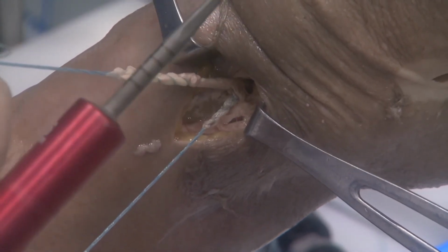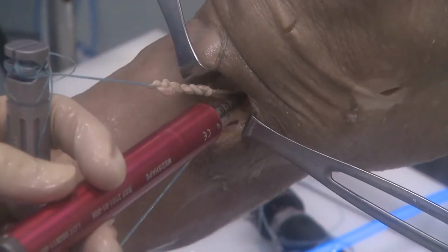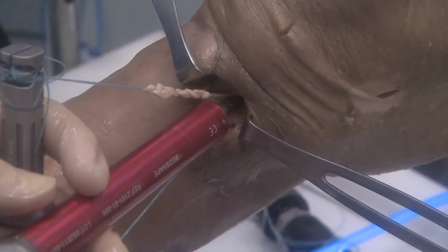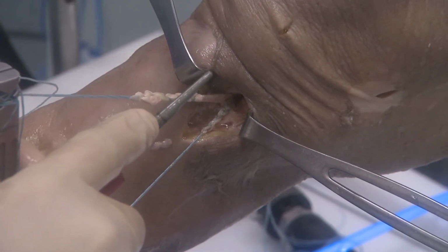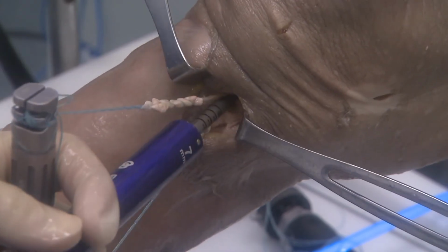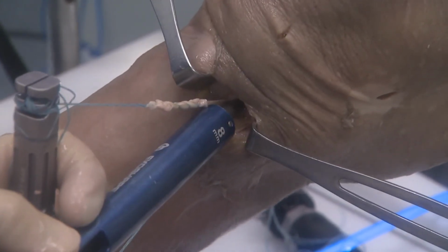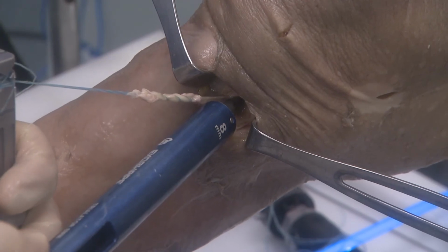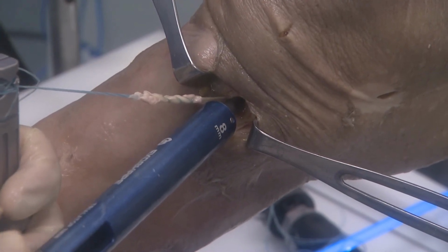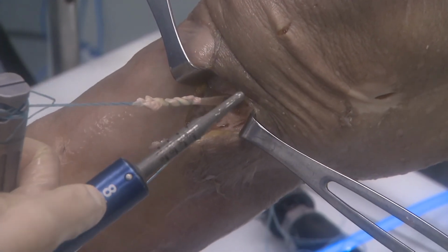If you dilate the tibial tunnel, you're going to get an increased pull-out strength resulting from compressing the cancellous bone against the wall. There's markings on these devices. That's 30mm in depth. The implant's 30mm, so I'll usually go to +5. And again, I'm keeping tension on the graft. I want to dilate up to a point where I cannot twist with 2 fingers within the tunnel, and I'm at that point here. So I remove this, and the 8 tells me I need an 8mm implant.